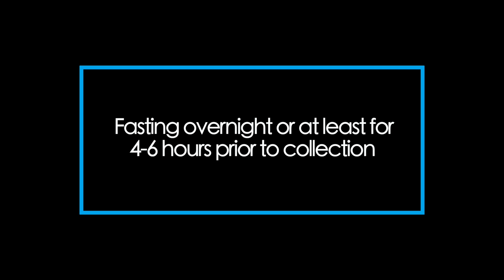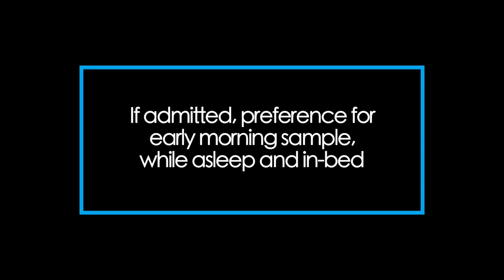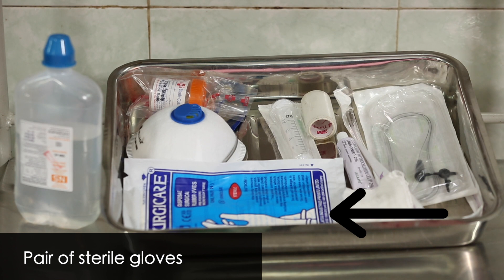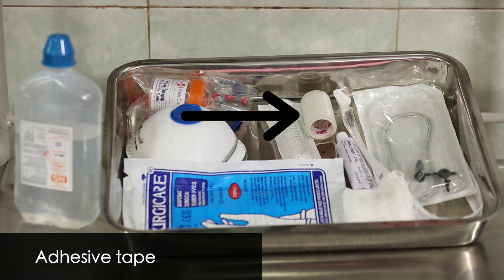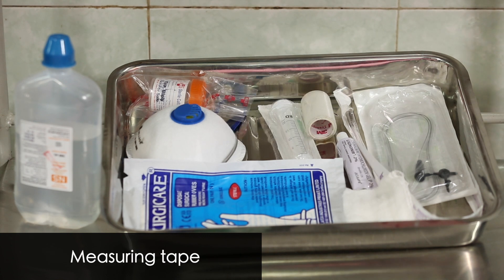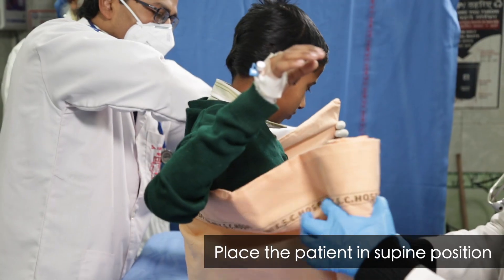The patient should be fasting for 4 to 6 hours prior to collection. In an admitted child, it may be done early in the morning while the child is still asleep and in bed. Instruments required for the procedure are: normal saline, a pair of sterile gloves, a Ryle's tube or infant feeding tube, adhesive tape, lubricant jelly, a 5 ml syringe, and a sterile specimen container.